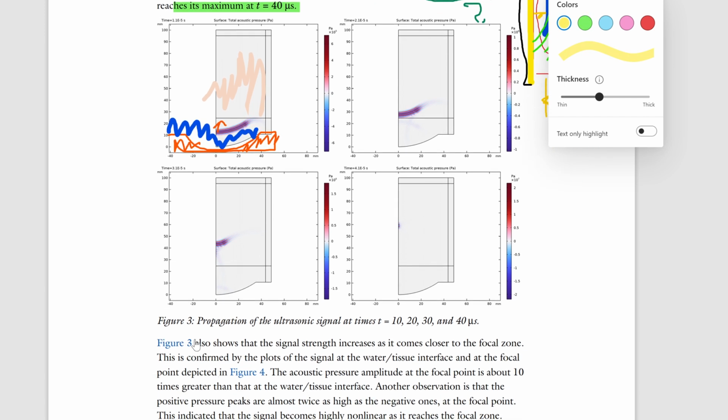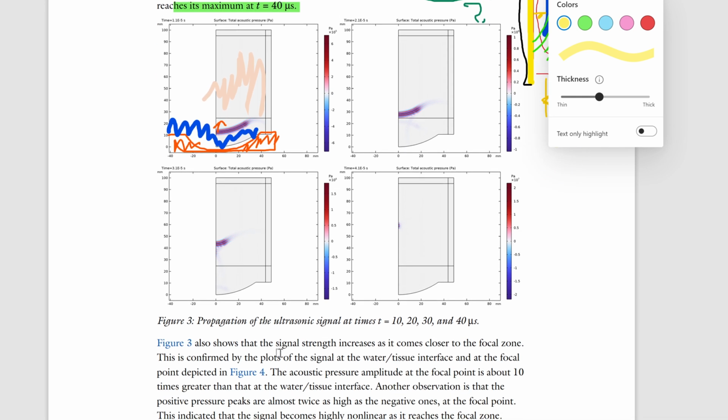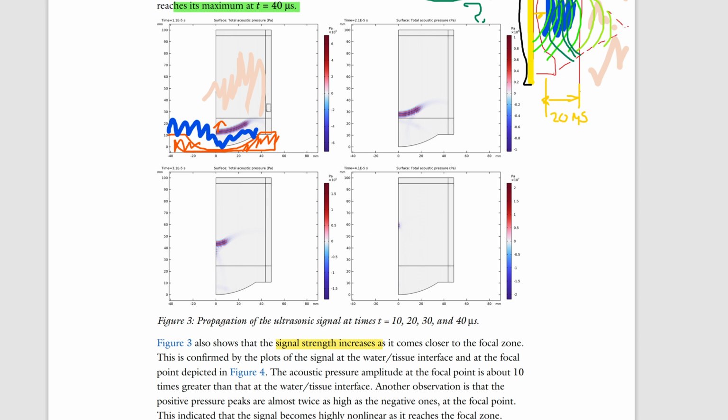Okay. So it also shows that the signal strength increases as it comes closer to the focal zone. Signal strength. And that pressure, is our pressure increasing? Because I noticed that our signal is becoming more focused. But that's the part that I was saying earlier where I don't see a difference in the colors. So the strength, how can we tell that it's increasing? I would like to see the numbers. Maybe I'm wrong about that. Let's go. This is confirmed by the plots. Oh, in figure 4. By the plot of the signal at the water tissue interface and at the focal point depicted in figure 4. Okay.